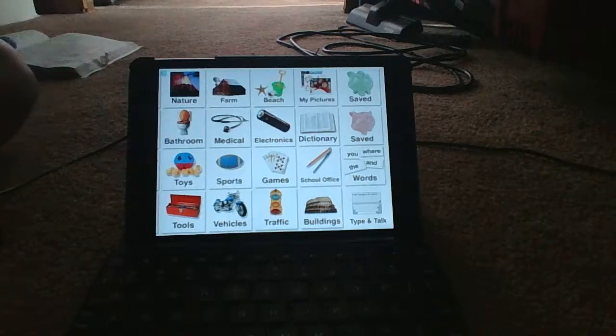Now, of course, in this case, Joey is in a Spanish immersion classroom, which means he can't use this particular voice output or type the English words. However, he is going to be raised in a culture and in a family that speaks English. And so those, once he's out of this kindergarten Spanish immersion classroom, are going to be his primary communication partners. He needs to be able to easily communicate with his mom and his grandma and the neighbor next door and whoever else. If they can't understand him due to his articulation issues, he needs a speech output device in English.